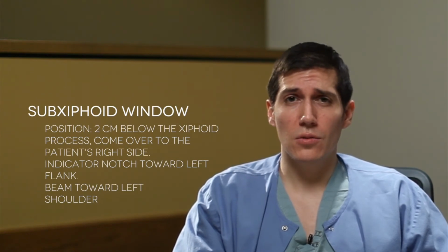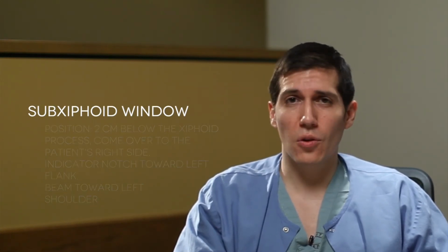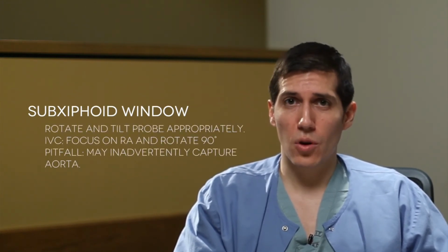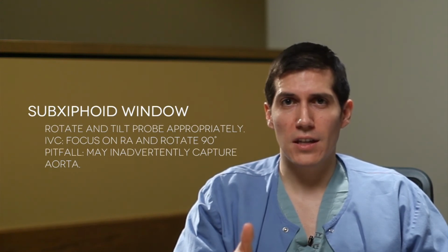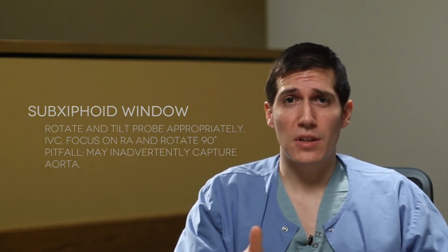And then you're going to have the indicator notch towards the patient's left flank with the beam towards the patient's left shoulder. And then finally, you're going to have to rotate and tilt appropriately. Knowing that, when you're trying to acquire the inferior vena cava image, you're going to focus on the right atrium and then rotate 90 degrees to be able to have the IVC really visible to you. And a pitfall, of course, that can happen is that you may have captured the aorta. And so practice, practice, practice.